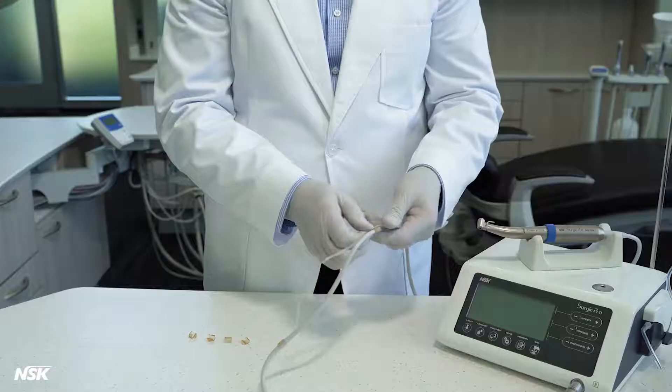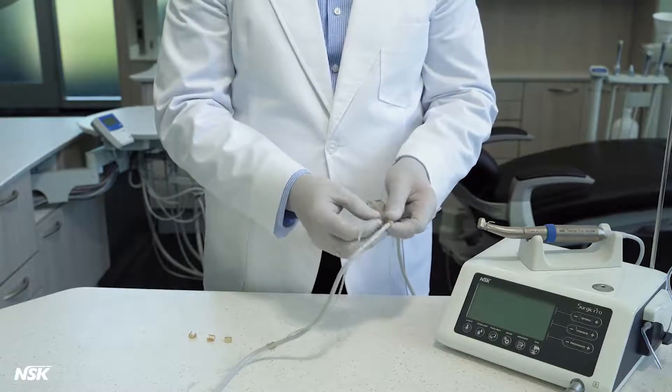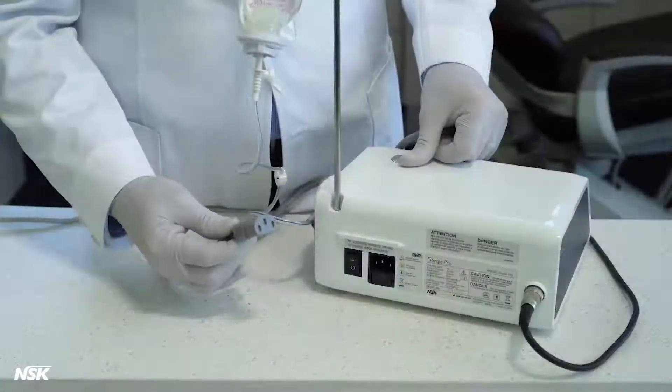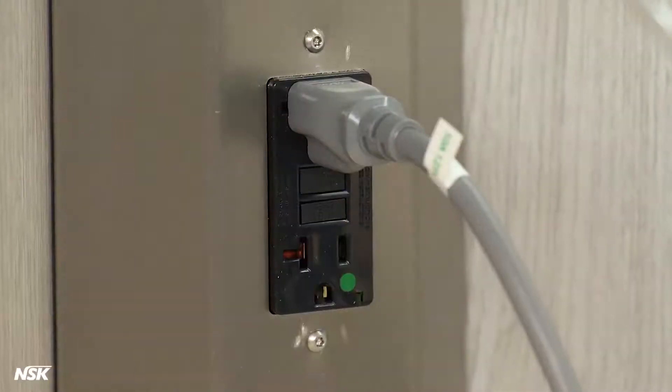The irrigation tube, however, cannot be autoclaved and is single use. Connect the AC power cord to the power socket at the back of the control unit, then plug into a power outlet.